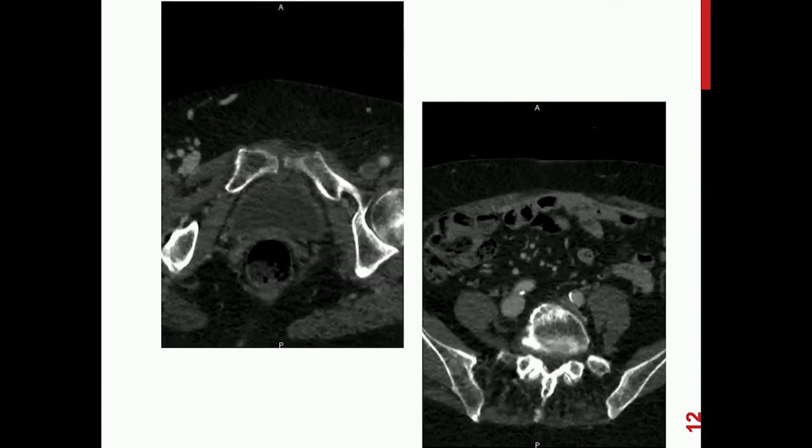In acute obstruction, it's somewhat more simple. We have just to look for the extent of the thrombus and look for a May-Thurner syndrome. This, for instance, is an example of a young lady that we have treated 2 weeks ago. We just have to see that the vein is filled with thrombus. Here the femoral vein, and we see also that the iliac vein is not visible. It's here, and it's chronically occluded, or it is a May-Thurner syndrome. This is why deep venous thrombosis occurs most of the time on the left side, especially in women.